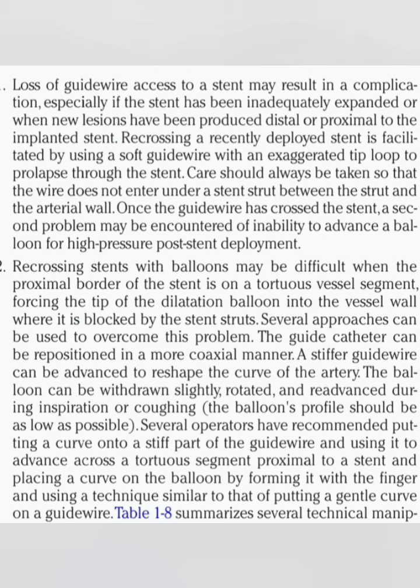Table 1-8 summarizes several technical manipulations that may be used to recross a deployed stent. Table 1-5 lists unique guide wire tip shapes that will help in difficult PCI situations.